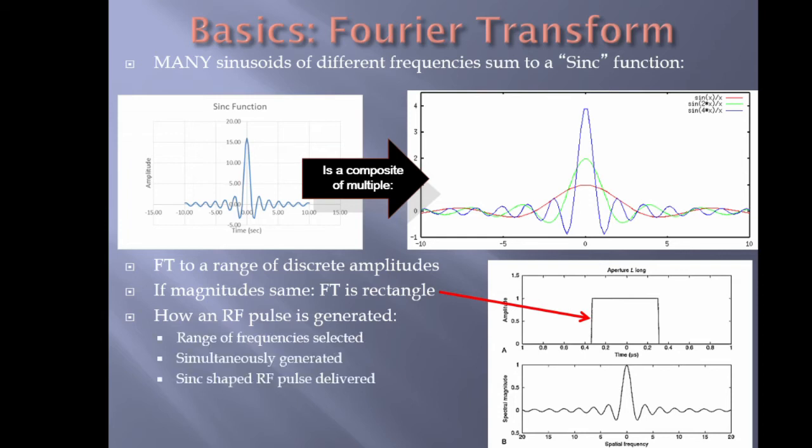weights or contributions. So in an RF pulse, we send out all these frequencies at the same exact intensity, right, which is a nice square wave, which gives us a perfect sinc pulse. But from a real body, since there are obviously supposed to be differences in spatial distribution, otherwise you'd have a great image, when you get this back, the wonky-eyed sinc function, and you Fourier transform it, instead of a perfect square wave, you're going to get a histogram, right? So each fundamental frequency is going to have a different amplitude, which is related to its relative weight or the presence of that precessing element in the imaging space.